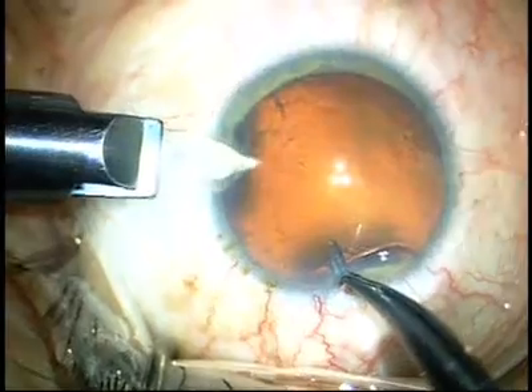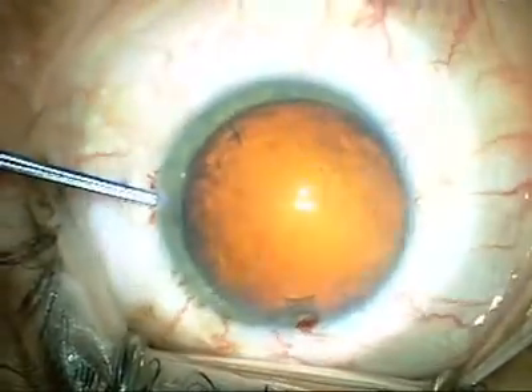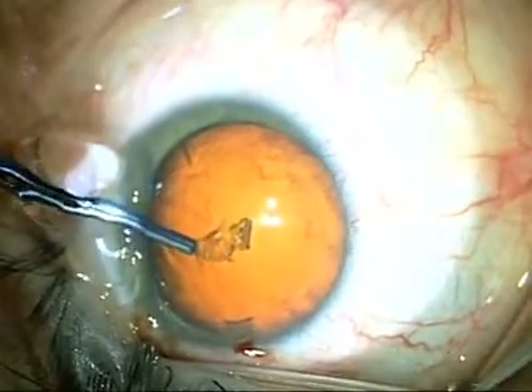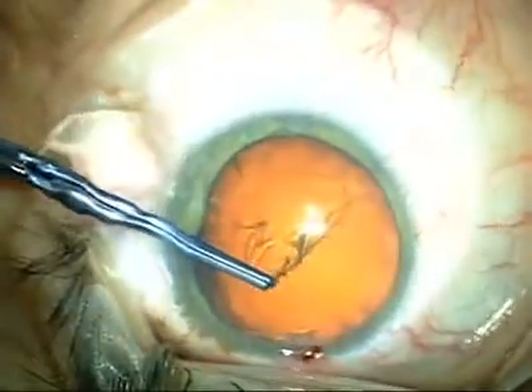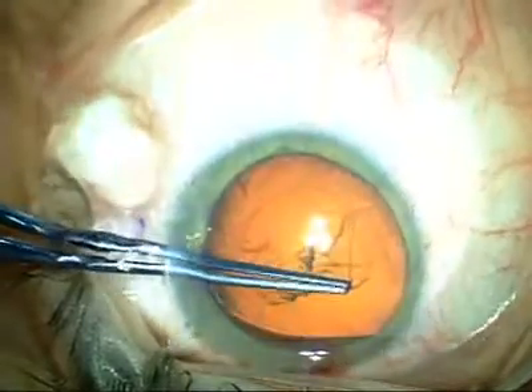The anterior chamber is quite stable when making the main incision. The combination of two cohesive viscoelastics creates a slightly different environment inside the eye to do a capsulotomy. The learning curve is relatively short, but you must be prepared to make an adjustment if used to using a dispersive as well as a cohesive while making the capsulotomy.